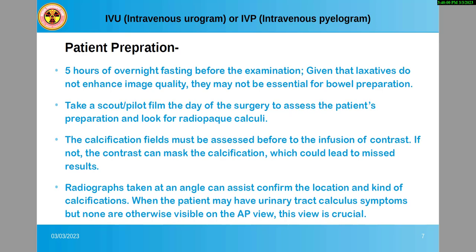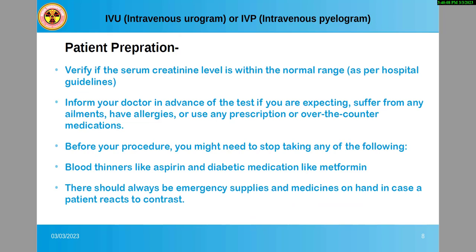When the patient may have urinary tract calculus symptoms, but none are otherwise visible on the AP view, this view is crucial. Verify if the serum creatinine level is within the normal range as per hospital guidelines. Inform your doctor in advance of the test if you are expecting, suffer from any ailments, have allergies, or use any prescription or over-the-counter medications.